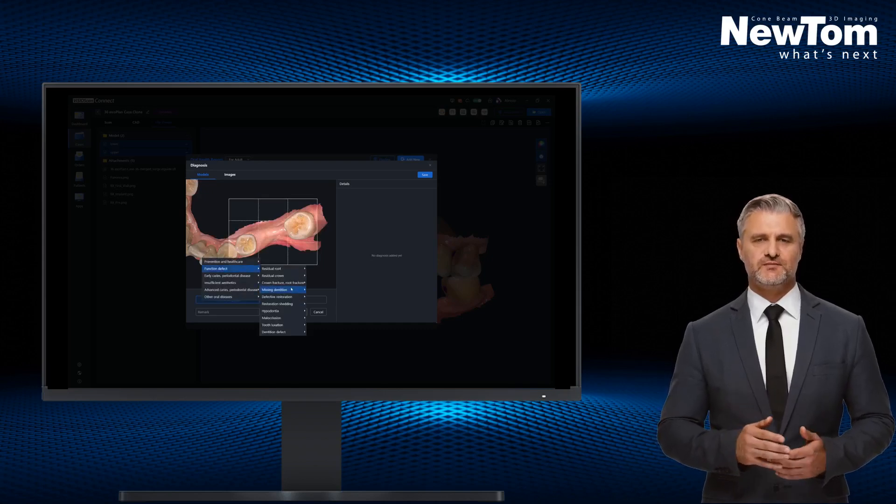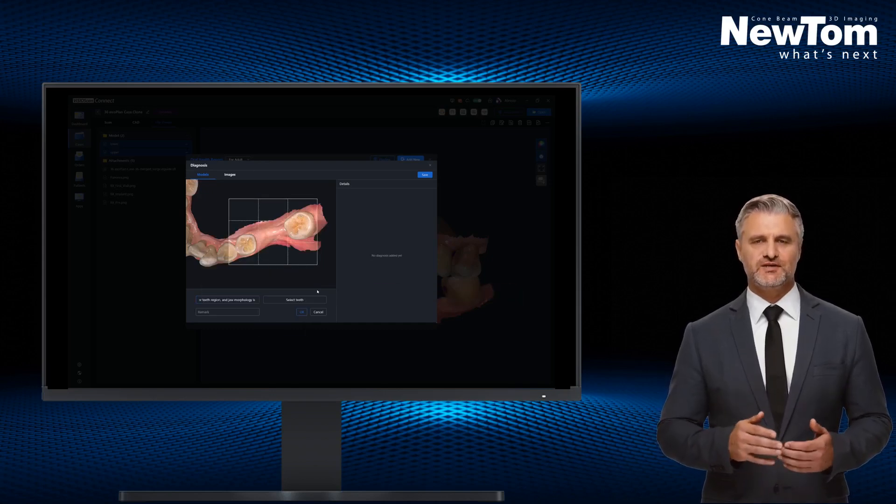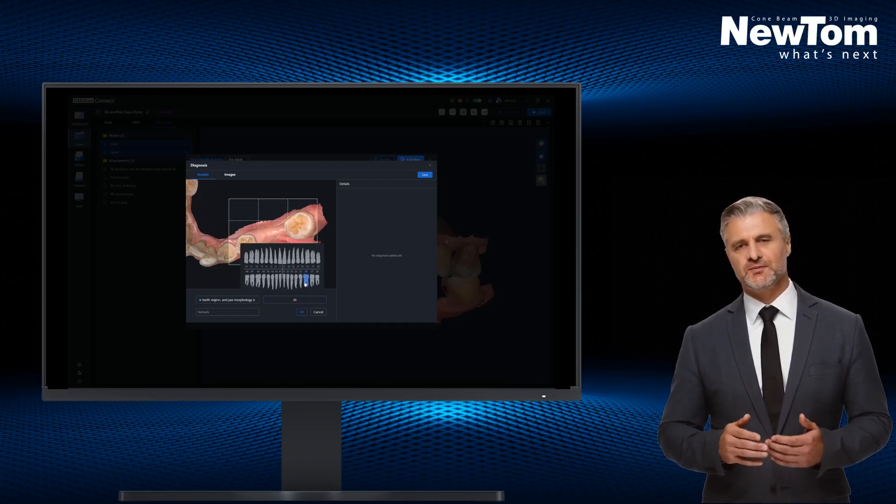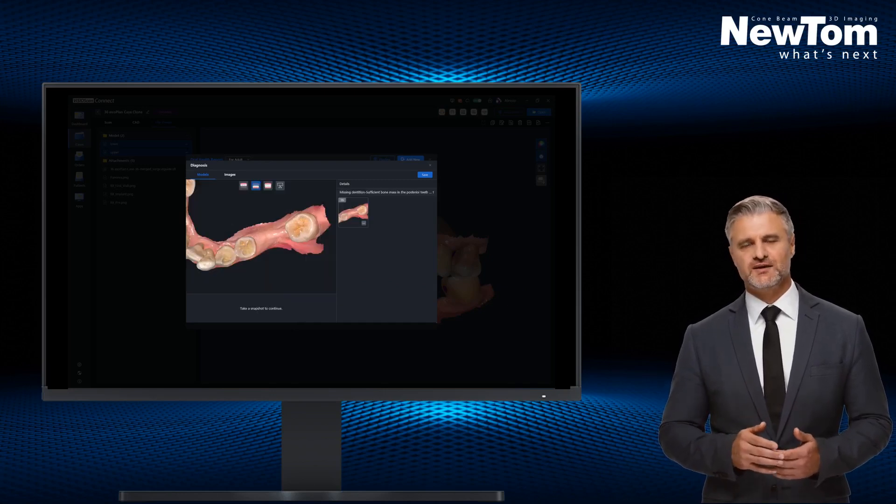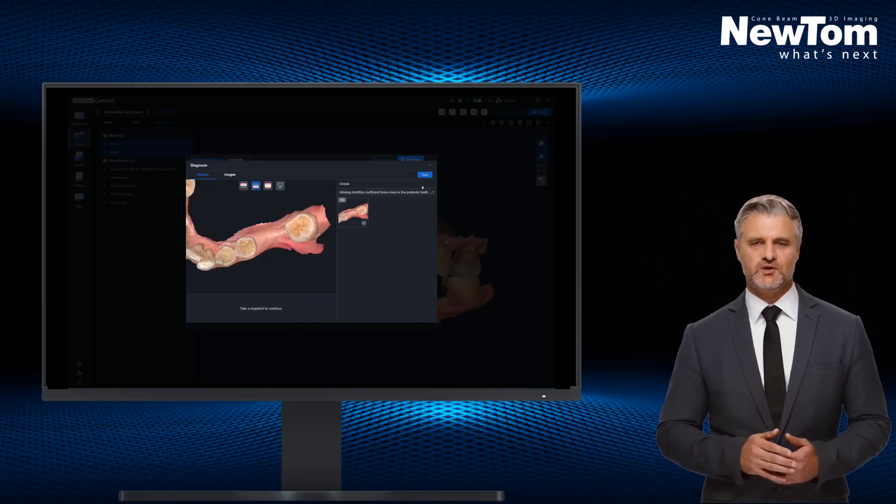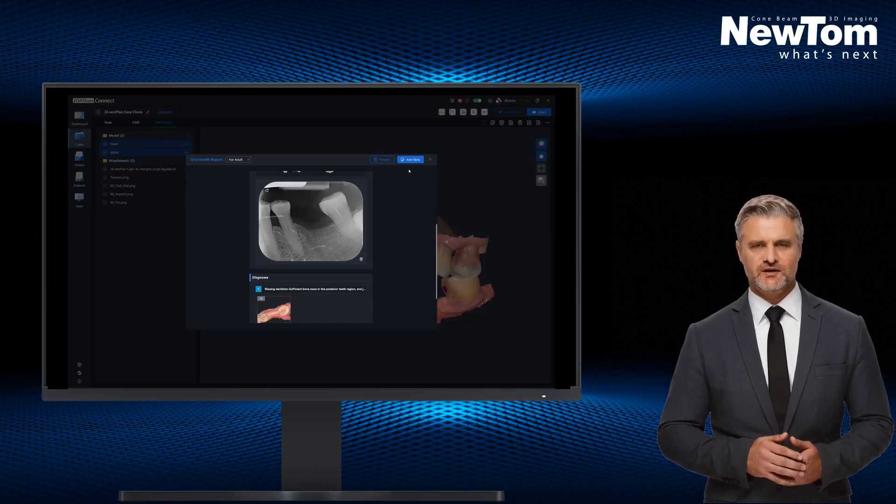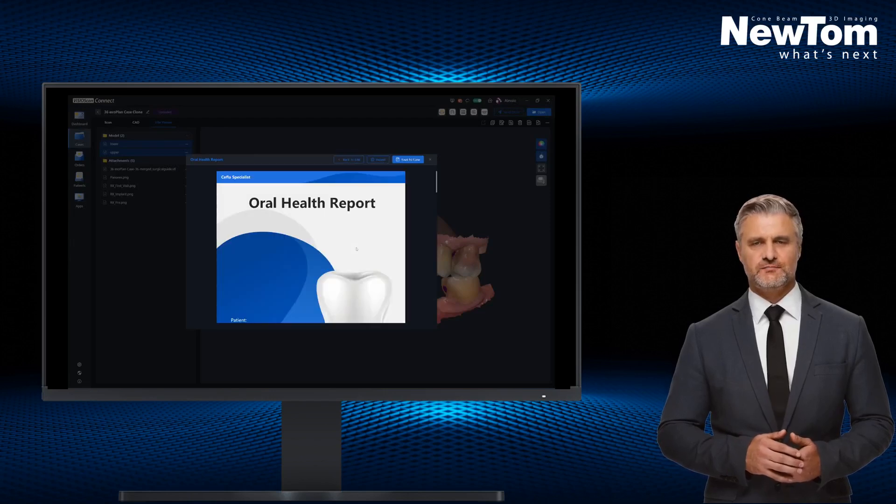By confirming with preview and then saving the report, we will find the report in PDF format with all data automatically formatted in the Clinical Case folder.